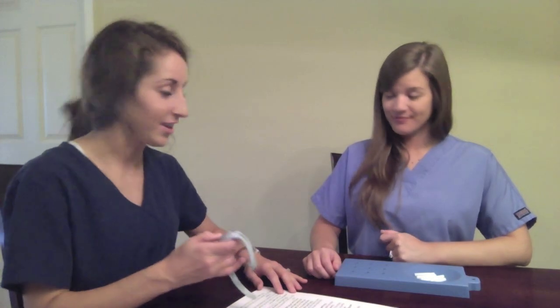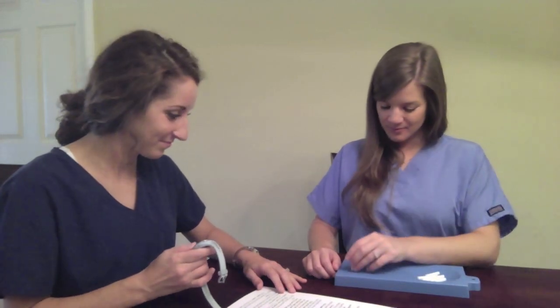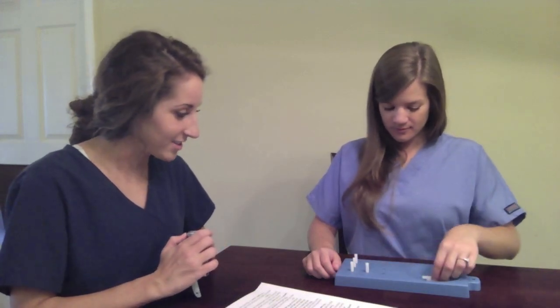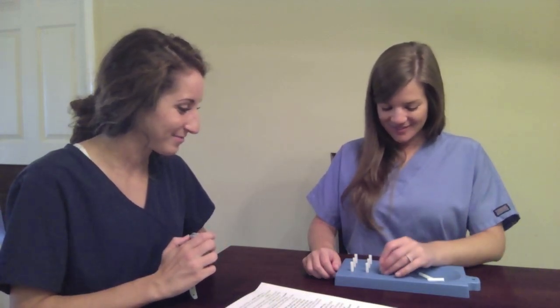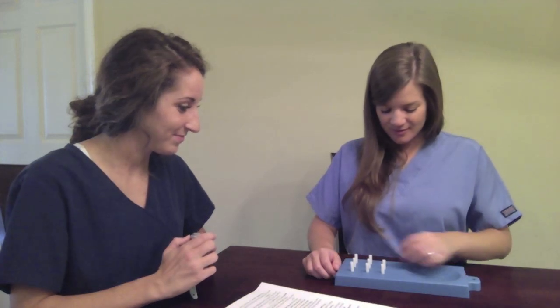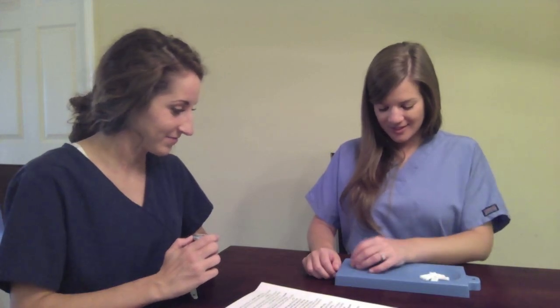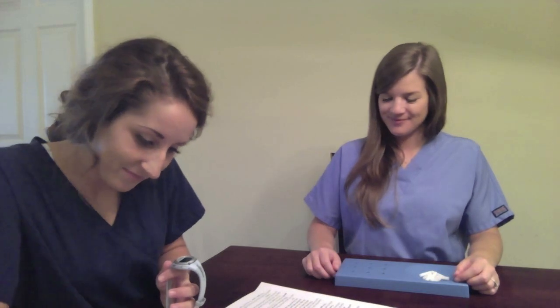All right, very good. Now, this will be the actual test. The instructions are the same. Work as quickly as you can. Are you ready? Yes. Go! Good job.